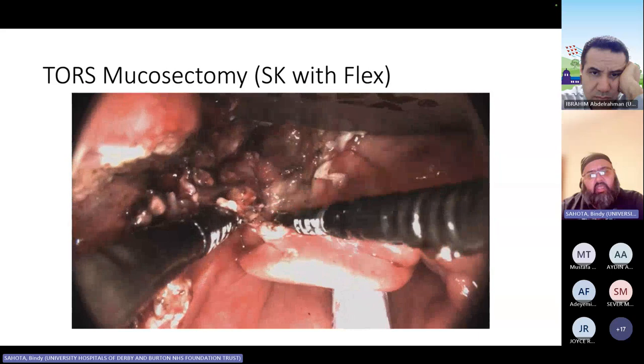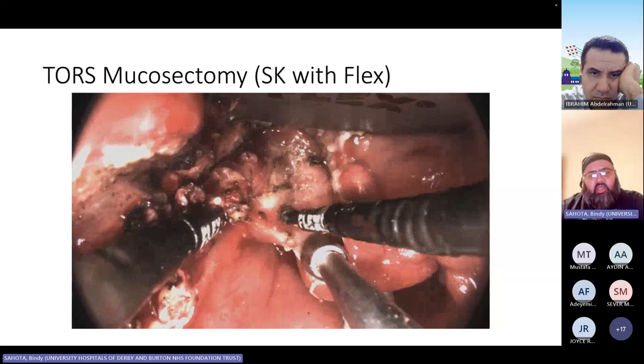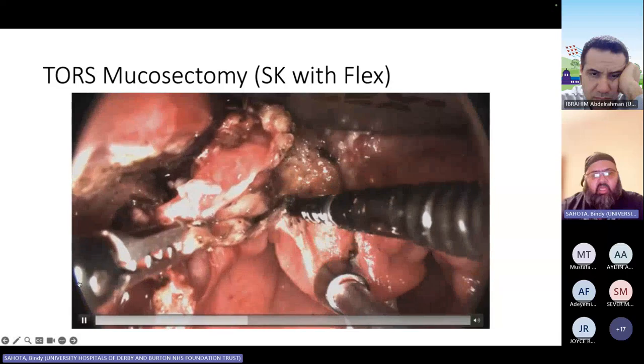And I suspect there's just some tonsillar cysts there, more than actual tumor, but they just look like little cysts. And you can see here, you're delineating it off the epiglottis and denuding the epiglottis. And you can see that epiglottis kind of whitey yellow bit coming out. So there's your tongue-based mucosectomy happening on the left. You'll see an equivalent bit happening again on the right.